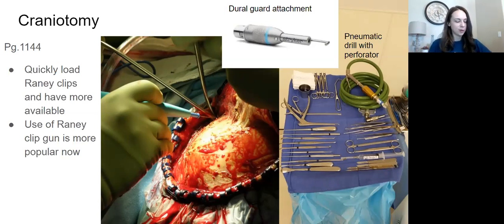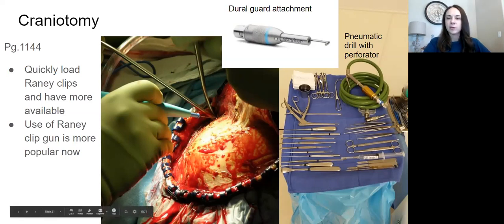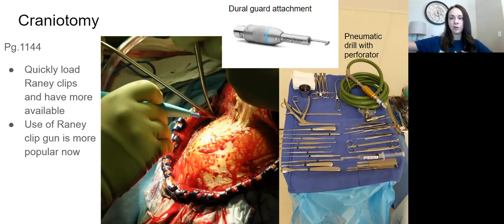So, frontotemporal tumor. As I said, after you make your incision, the first thing they're going to do, stop the bleeding of course, but they are going to attach these Raney clips. You can see right back here, the scrub tech has the Raney clips loaded, ready to go, and then a cup full of them. This is typically how you're going to apply Raney clips. You have to pass them over and load another one as they're applying. They're going to throw it on your Mayo stand, you load another one. This is a constant, your hands are moving very quickly thing.